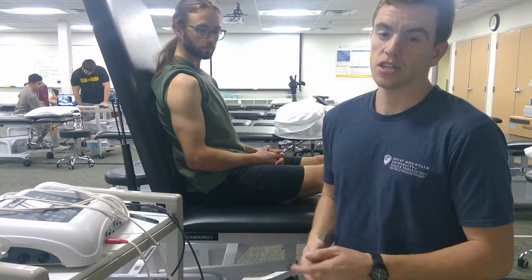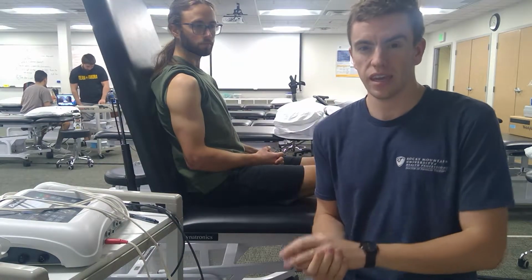Some of the contraindications that I would be concerned about are whether or not he has a pacemaker, any cancers in the area, any loss of sensation, or if it were female, I would ask about plans, or if there is a pregnancy, if we're working in the torso or low back. So the purpose of this is to stimulate the A beta nerves to help reduce pain via the gate control theory. And so that's my plan. I'm going to start working with the patient.